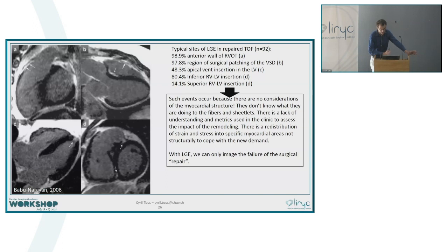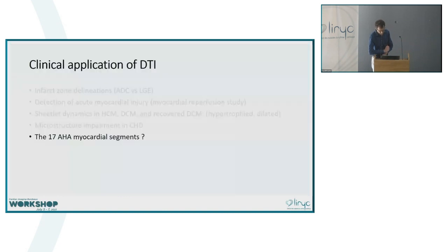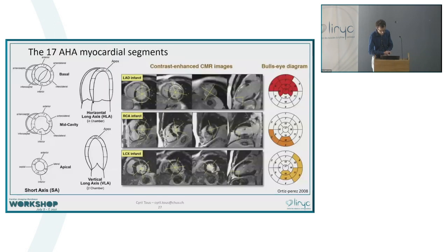So with LGE, we can only image the failure of the surgical repair. What we need to do is investigate the structural remodeling to better understand the consequences of surgery, which could provide better predictable outcomes. Shortly about this is just a point of view I have.